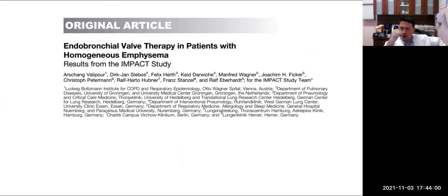Now, I just want to switch gears and talk to you a little bit about homogeneous emphysema, because homogeneous emphysema has never been part of the discussion until the valve technology came out. Right, in the NETT trial, it was always heterogeneous, and the clinical teaching for us as pulmonologists for years has been homogeneous is not appropriate. However, as I told you earlier, valves are approved for homogeneous emphysema.